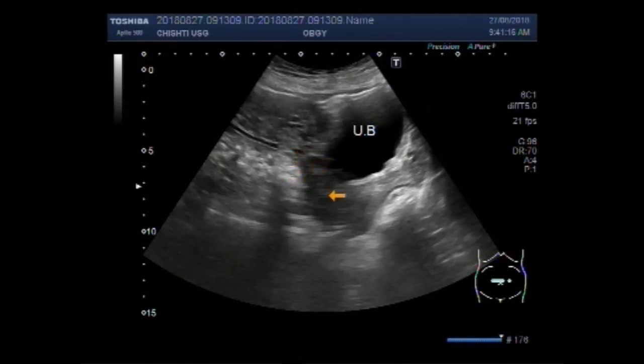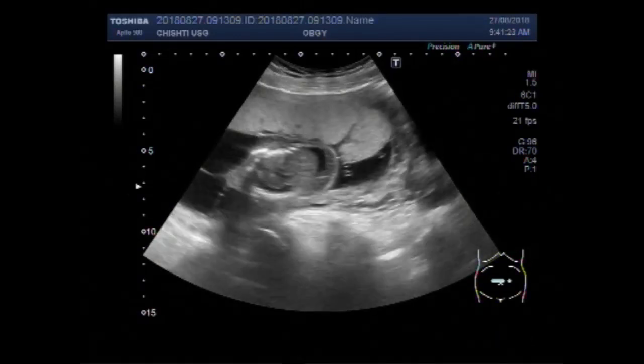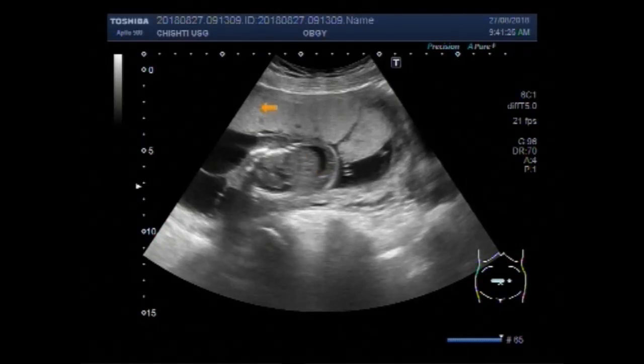You can see the uterus, the cervix of the uterus, and now the fetus. You can see this is the placenta.